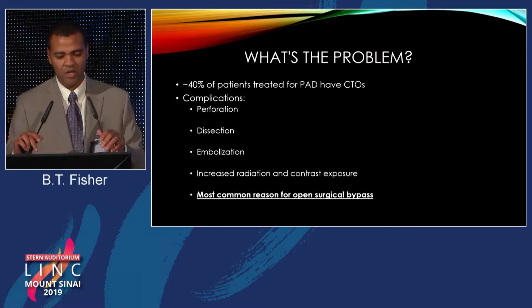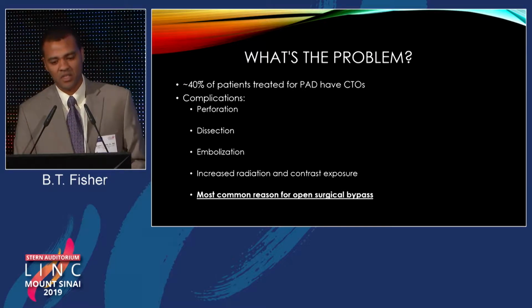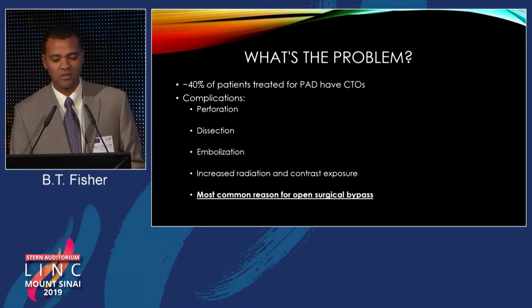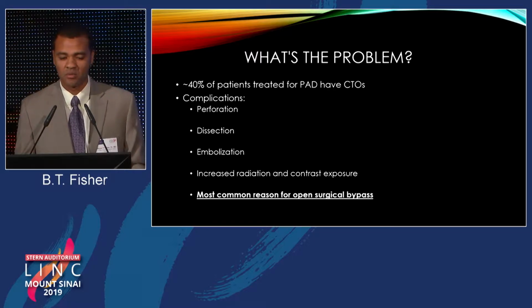You've heard many people argue that we should have an endovascular first approach, and obviously if you can't cross the lesion, then you can't treat it. You cannot have technical success without that. And so again, that leads to an open bypass, which again, in the right hands, is not a bad thing and is a durable procedure for the patient.